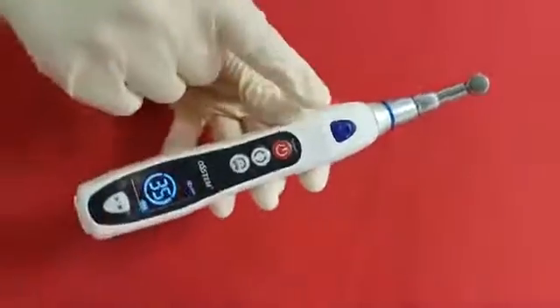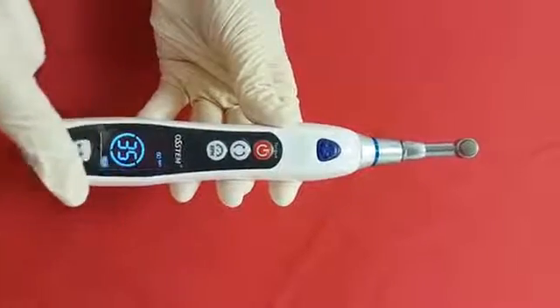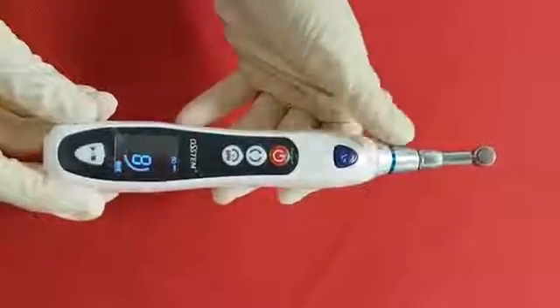There are 2 operating buttons here on the top and the bottom. This white button is especially for the posterior area. Motor runs only when the button is being pressed.